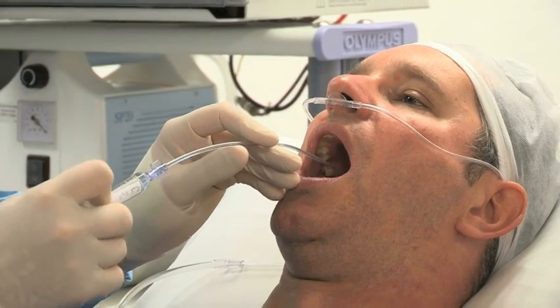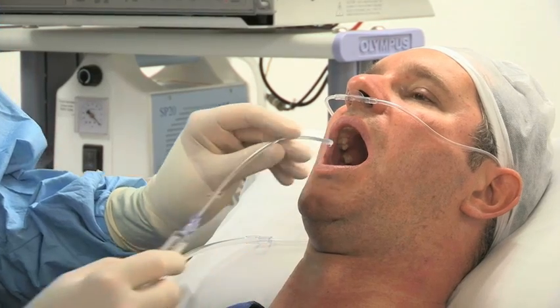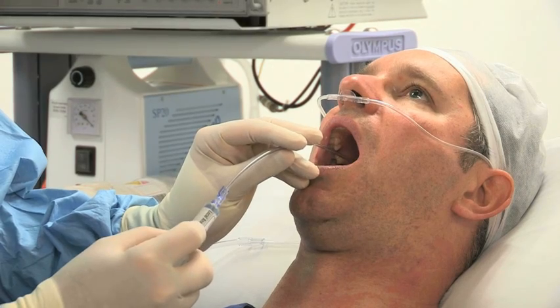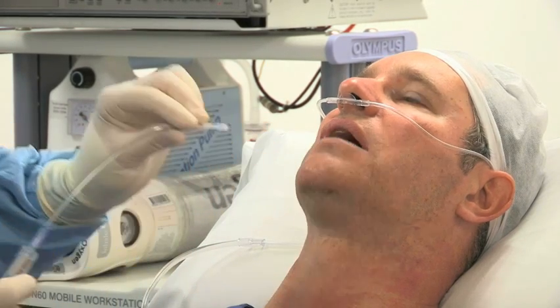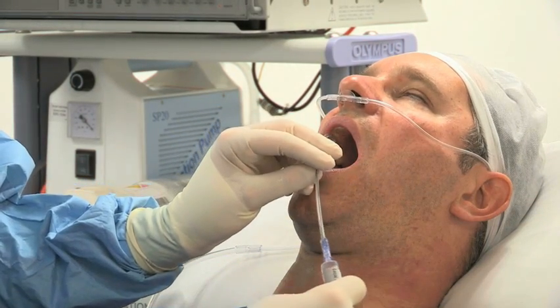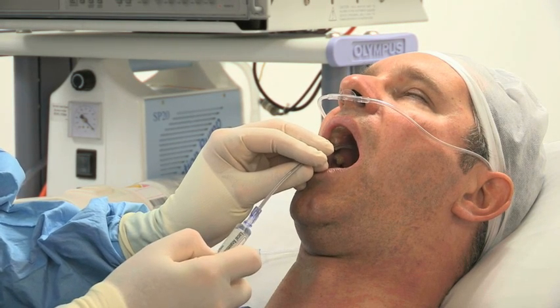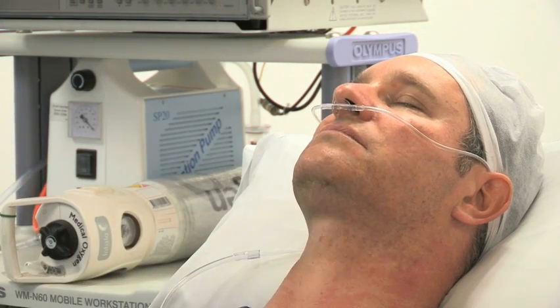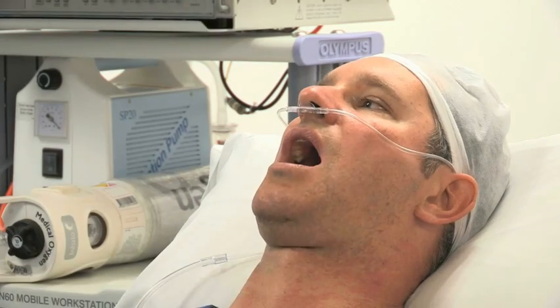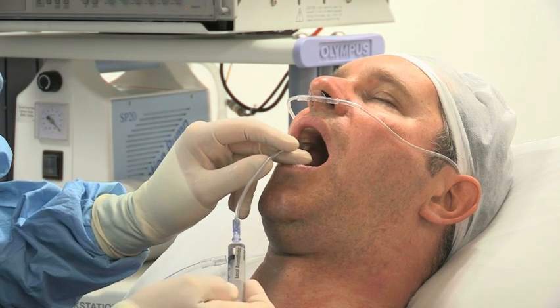Again, using an atomizer, spray both tonsillar pillars and then the posterior pharyngeal wall. And finally, direct the atomizer downwards to spray towards the cords.